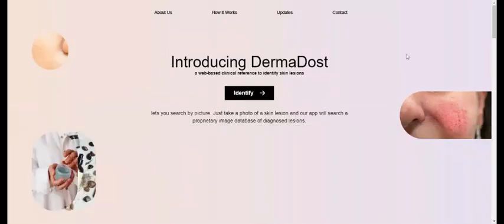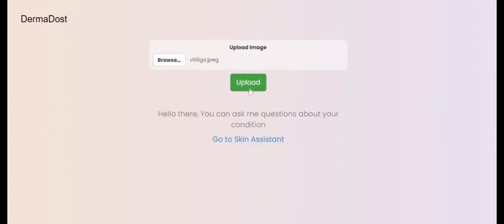So now from the point of view of a user, how are we going to use this application? Let's say you have an image of your affected region. You have to go to the identify section, where you will have an option to upload the image. You can browse it, select it, and upload it.